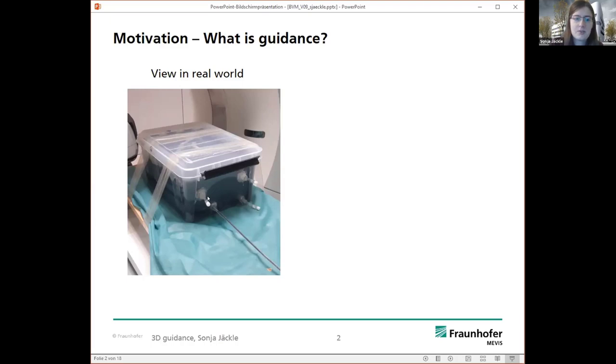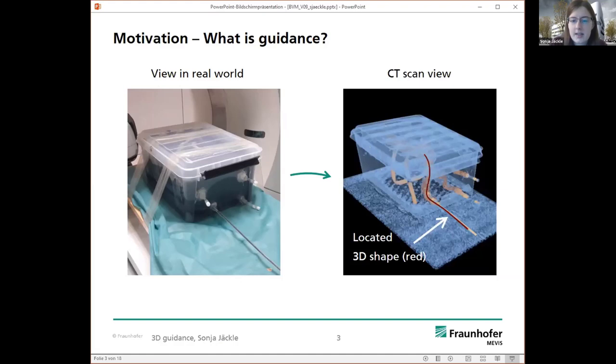However, it's a minimal invasive procedure we are having here right now, so you have one access point where you inserted your medical instrument, and you do not know from the outside where is your tool right now inside this phantom. And for this we need a guidance, so we need the information, where is my stent graft catheter, my instrument I have inserted, and we can see here in red the position here, and where it is in the vessel, and then we can navigate to the position we want to be in at the end.